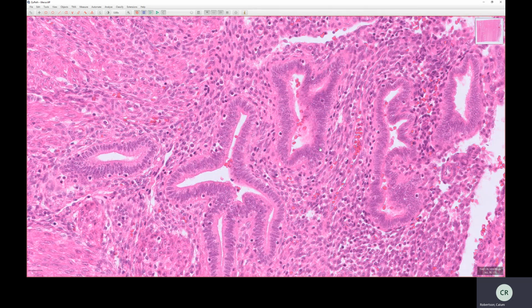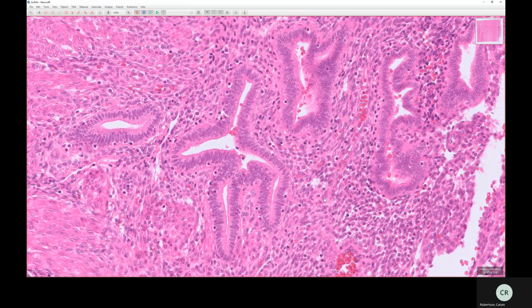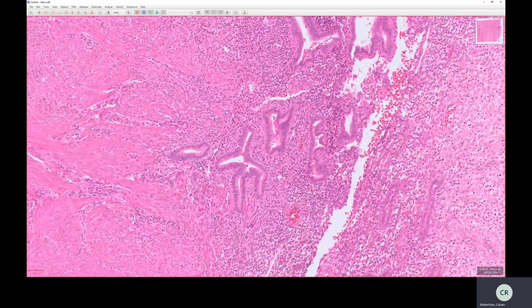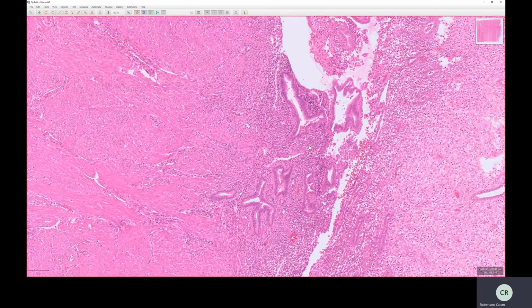So these are endometrial glands with elongated nuclei, which don't have mucin in them, and they're surrounded by stroma, which is kind of haphazardly arranged, quite cellular stroma made of these cells with round to ovoid nuclei, which are quite tightly packed, which are quite blue-looking at low power because it's mostly nuclear material. So keep that in your mind, and we'll revisit that when we look at the cervix.